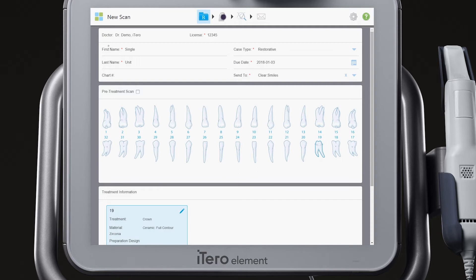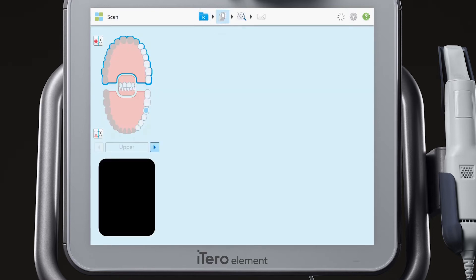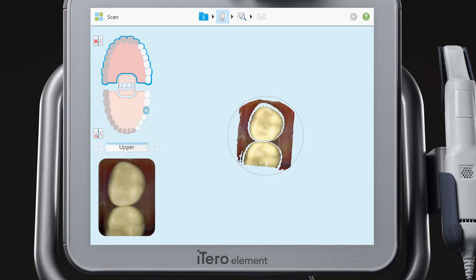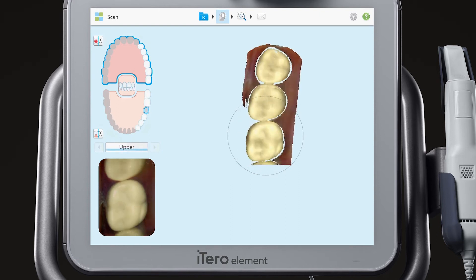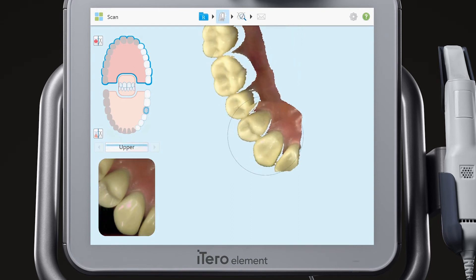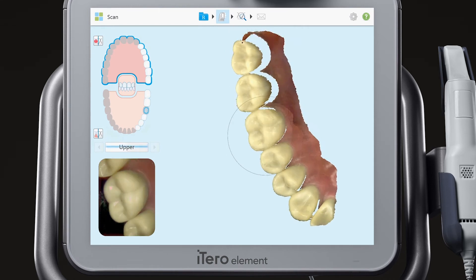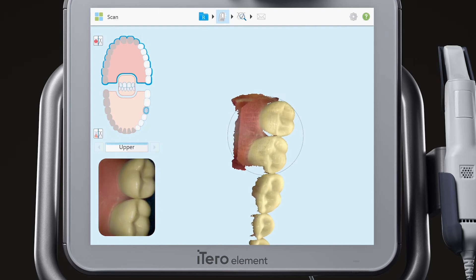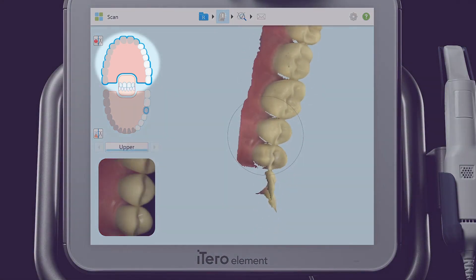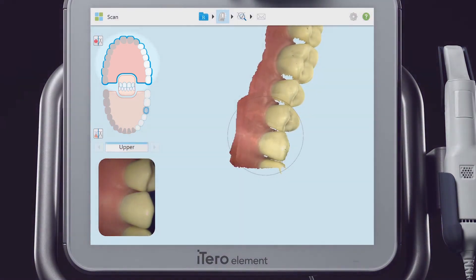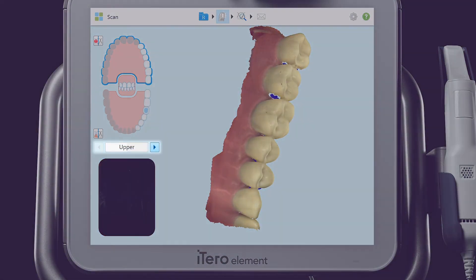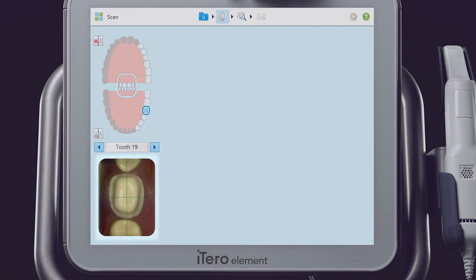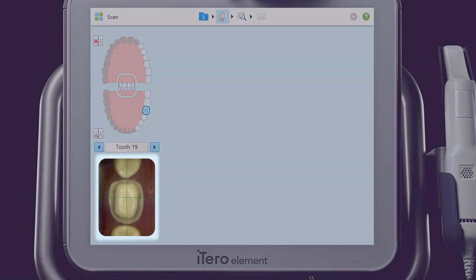Tap on the scan icon. Begin scanning the occlusal, lingual, and buccal of the opposing arch first. Notice the blue outline for the active scanning segment. Use the arrows next to the segment indicator box to move to the next segment. Place the crosshair in the middle of the tooth to center the prep.